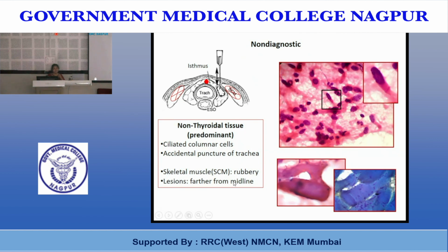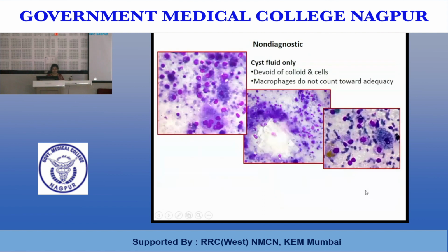And sometimes if the lesion is further placed under the sternocleidomastoid muscle, you may pull out the muscle, which is very painful for the patient, and you can see that the muscle is there for you to see.